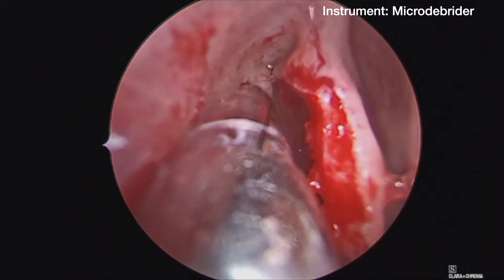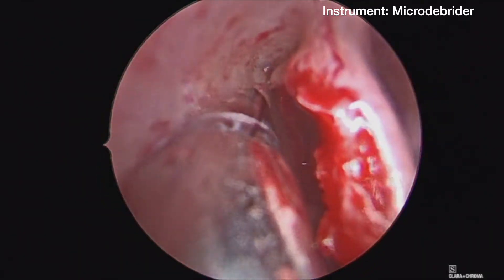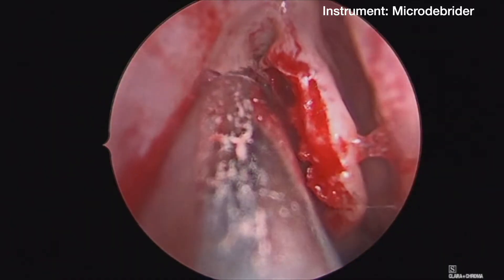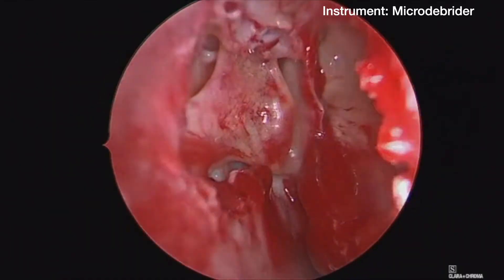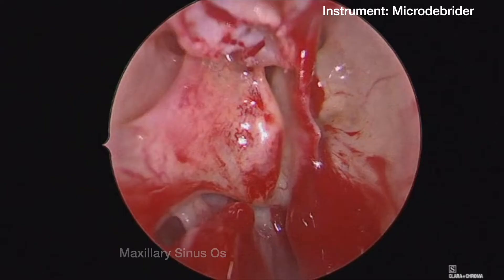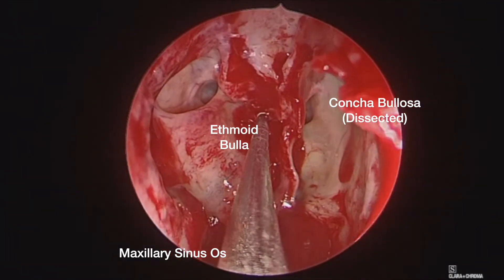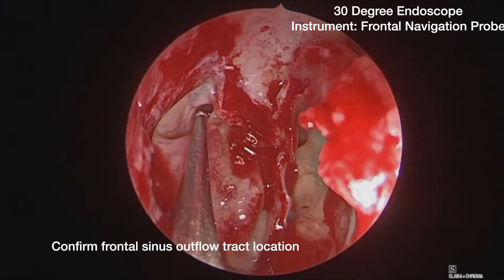It is important to always be able to visualize the door of the microdebrider and to bring the free mucosal edge medially so as to protect the orbit. After uncinectomy, here is the view of the surgical landmarks: the maxillary sinus os, the ethmoid bulla, and the dissected concha bullosa cell.